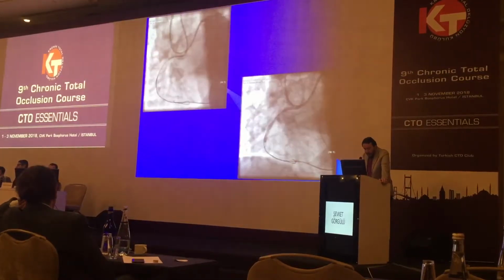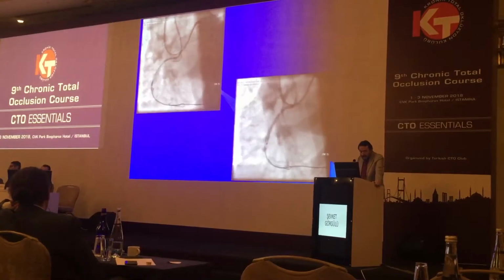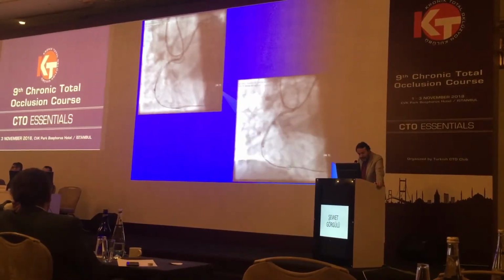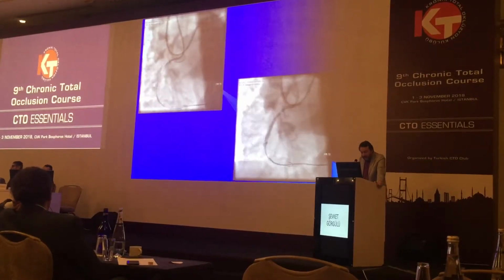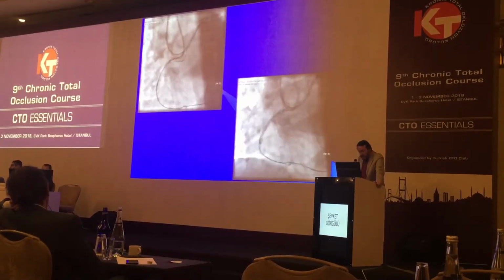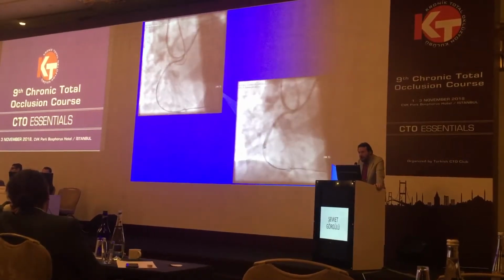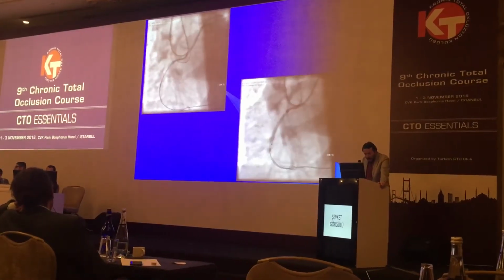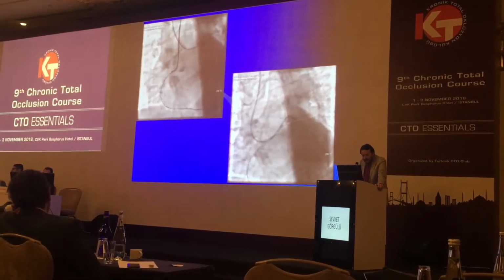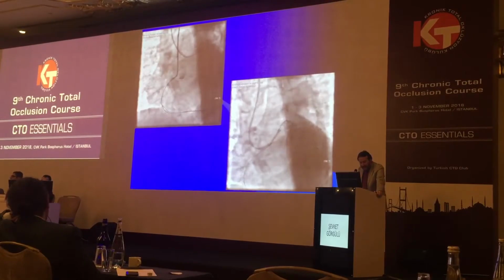A new looped Gladius was advanced distally, retrogradely. We tried with the Fielder XT to catch the antegrade guide. One can see the XT wire is looping in the aortic dissection. With antegrade ballooning, the preparation was done for a new retrograde crossing attempt. Eventually, the Gaia 3 wire caught the lumen and entered the antegrade guide. The wire was trapped and the Corsair advanced into the RCA catheter.